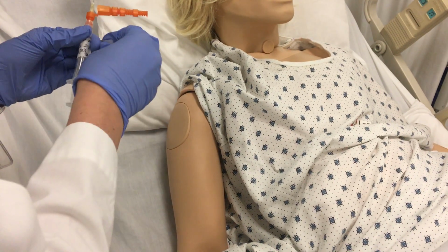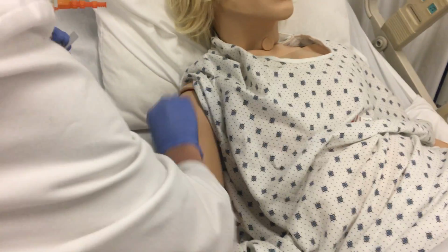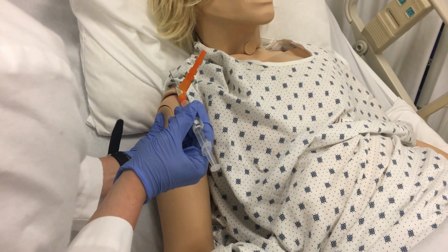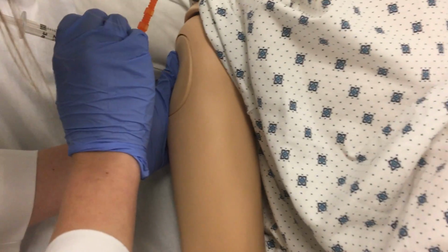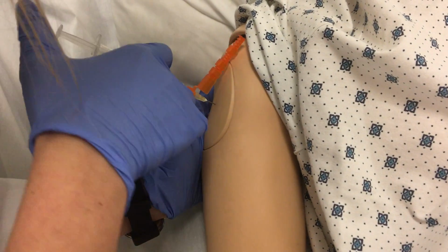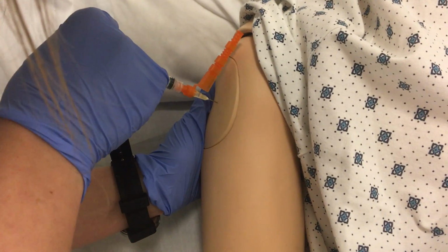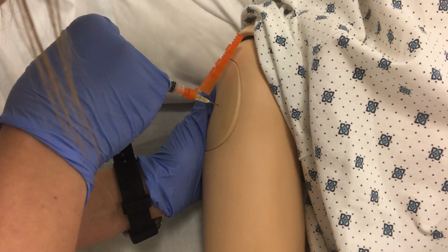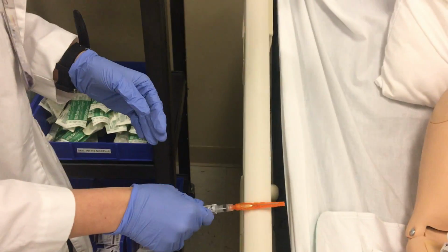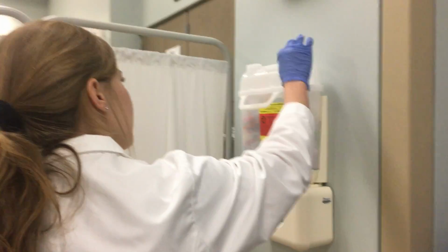I'm going to start by cleaning the site from in to out. Again, I'm going to pull the skin taut and go in at a 90-degree angle. I'm going to administer slowly and hold for 10 seconds. And then I'm going to initiate the safety and put this into my sharps container.